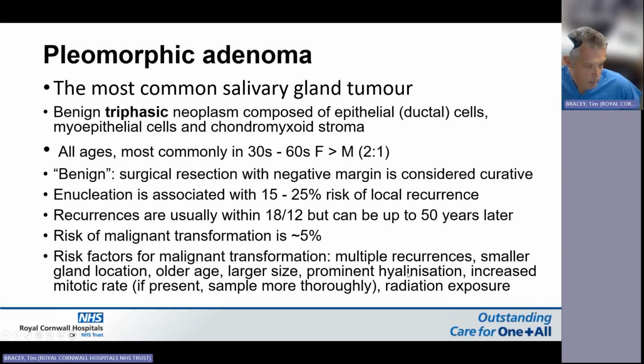Prominent hyalinization, this is something I didn't know until I started looking this up. If you get increased mitotic rate, it's not necessarily a worrying factor, but I would say sample more thoroughly if you do see it.